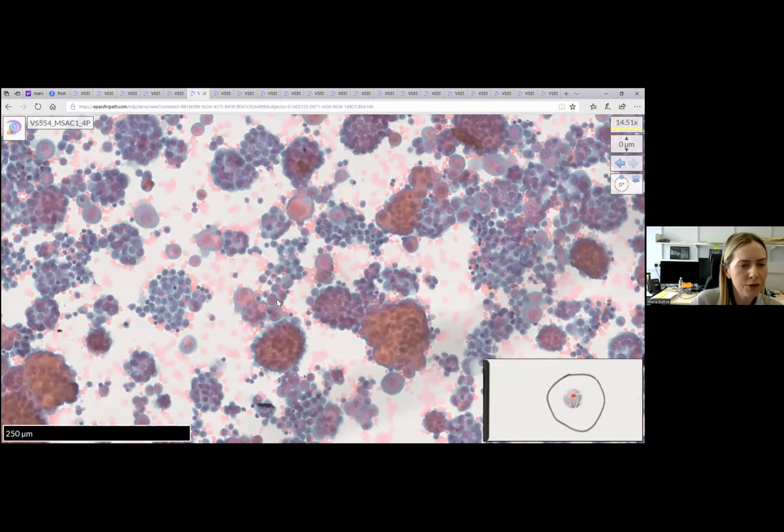So if you're confident that you can identify these as mesothelial, then you wouldn't need to do a BER-EP4 or a calretinin, but that could be part of your panel. So a BER-EP4 or a MOC31, which would be positive in adeno and negative in mesothelial cells, and then a calretinin, a WT1 or a D2-40. And then once you've identified those as mesothelial in origin, you could then go on and do a desmin or an EMA, or also a BAP1. I know BAP1 isn't always easily available in all hospitals, but essentially loss of nuclear BAP1 staining is positive in up to 2/3 of mesotheliomas.